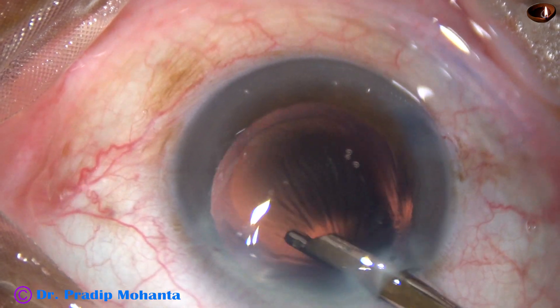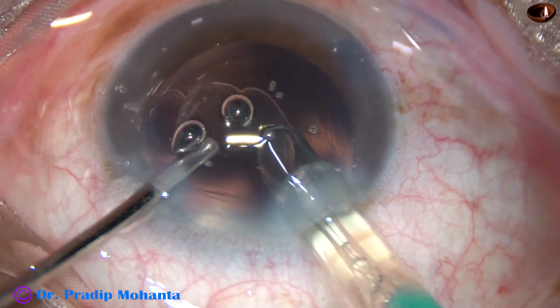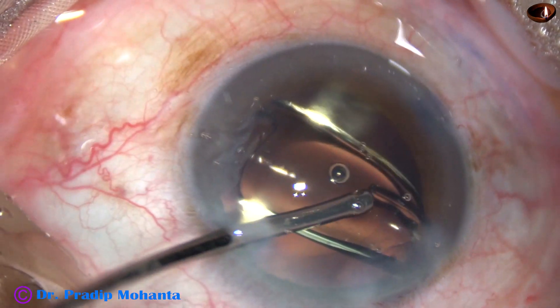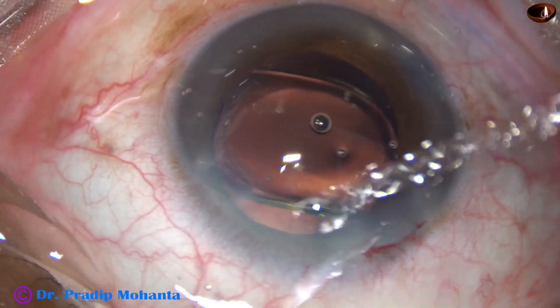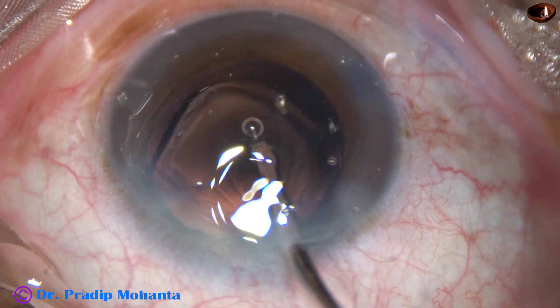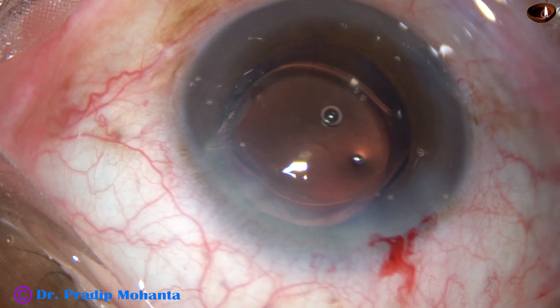Now this is haptic implantation of a single-piece monofocal intraocular lens from Appasamy Associates, known as Super Fovea. The lens has a yellow tinge. I have been using this lens for the last 7-8 years and have not found any glistening in this lens.